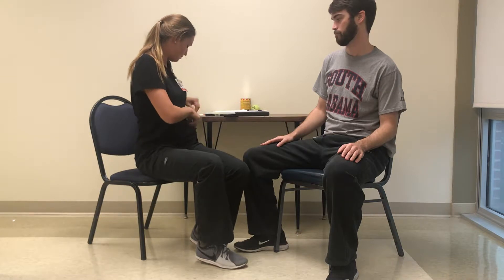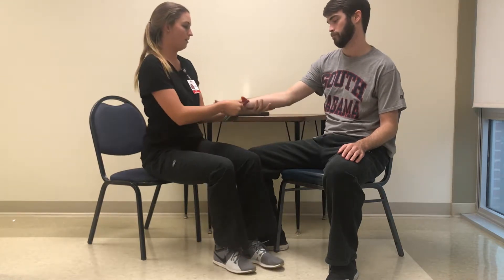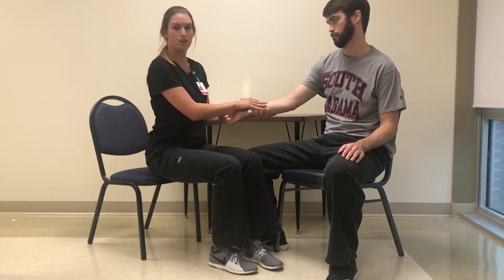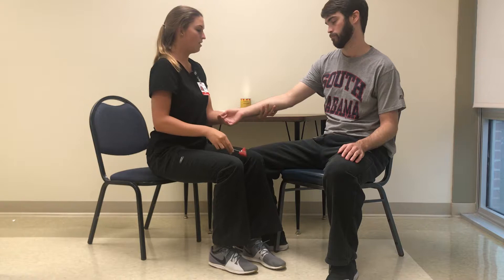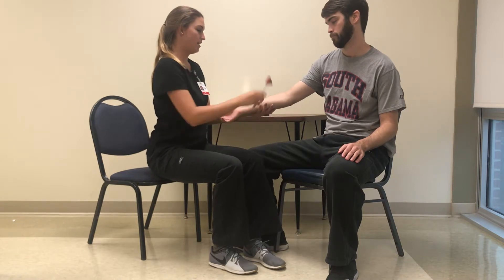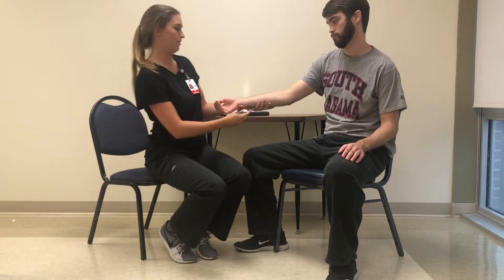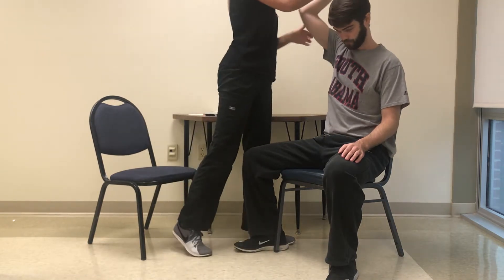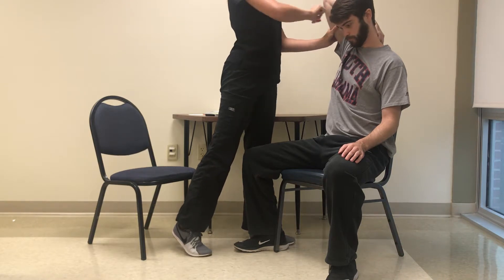To start, I'm just going to have you relax your arm. This is the unaffected arm, so you always start with the unaffected arm. Have them relax their arm and then I'm going to hit right here. There you go. And you check for reflex. And then bring the arm up to do extension. Hold it here. I'm going to tap here.